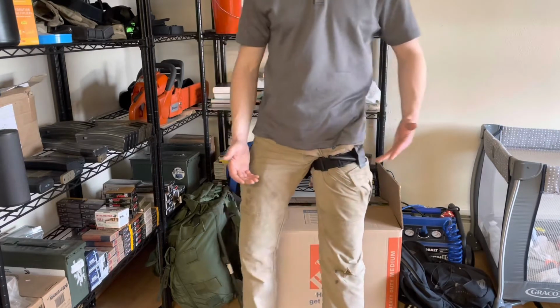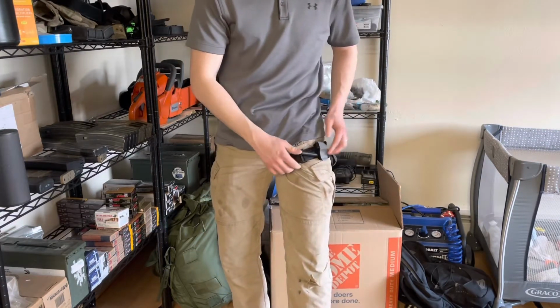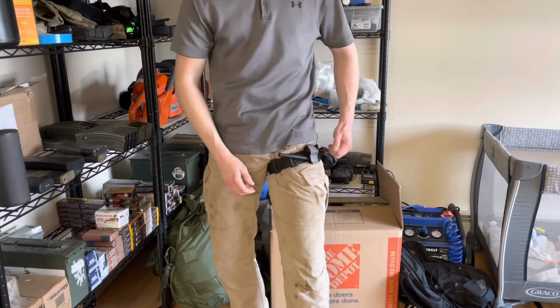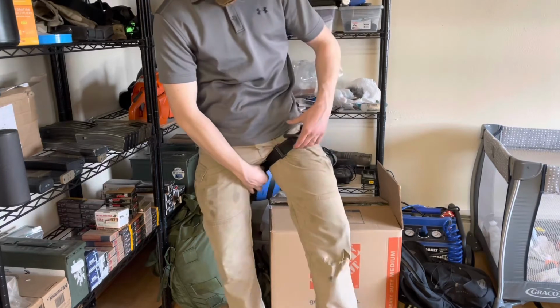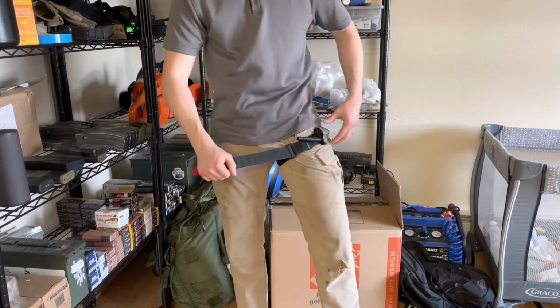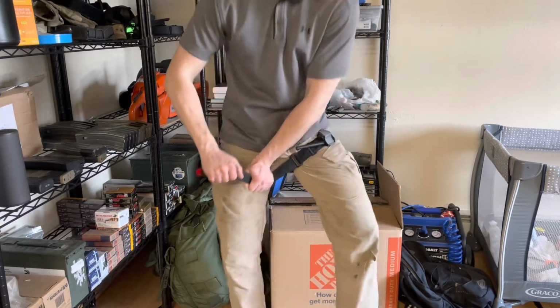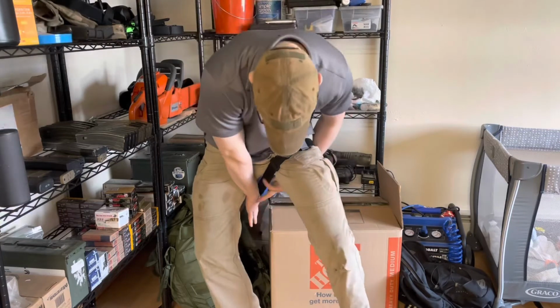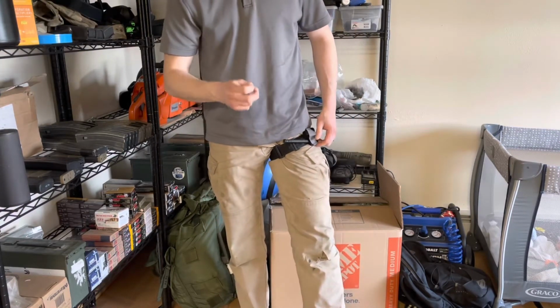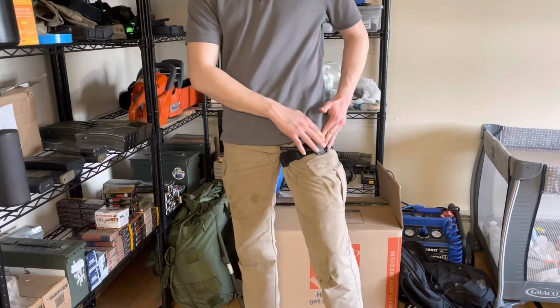The reason that's important, let's say this is already twisted up, right? Your inner band is already constricted, and then you pop this. If you watch, I'm going to lose all my friction. See that? So if I do that and my inner band is already all matted up, you can't simply just re-go your tourniquet and then start spinning. You're not going to have as effective of a tourniquet that way. So it's critical that you secure this tab and make sure that it doesn't go anywhere.